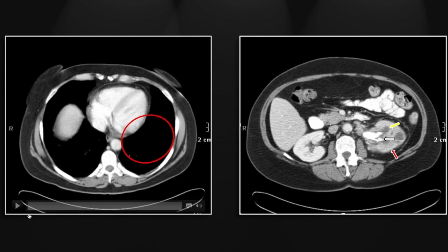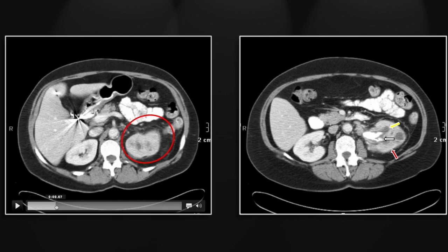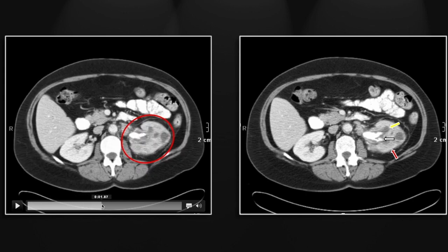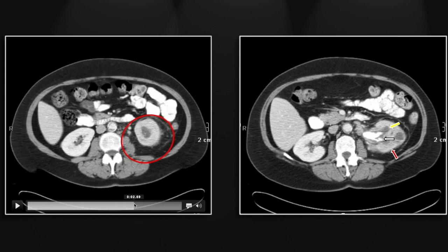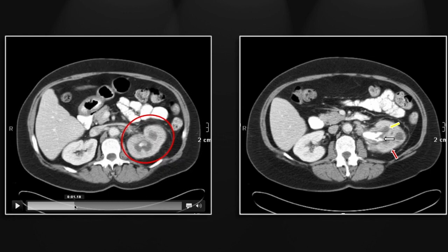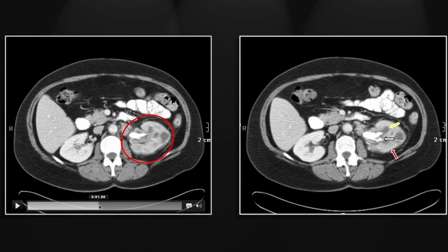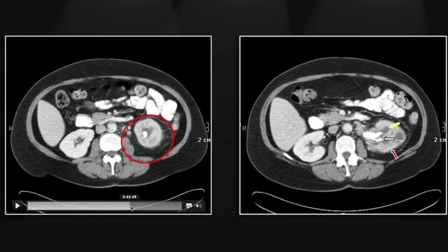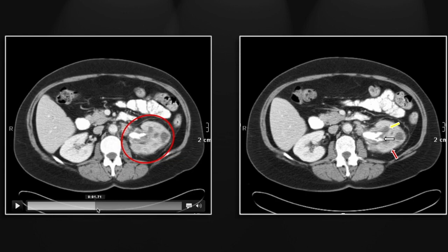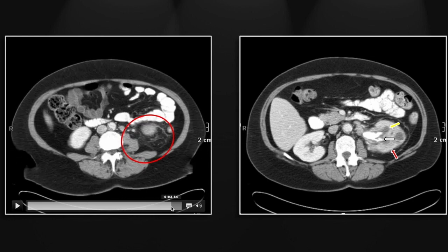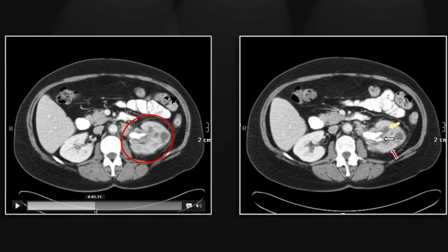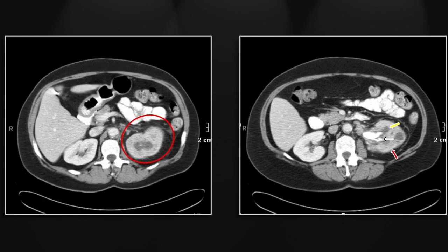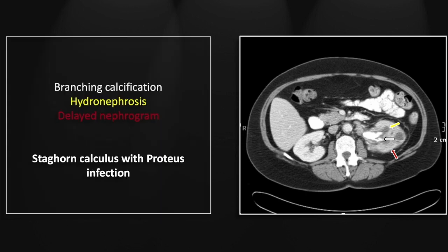This was the classic proteus infection superimposed on this staghorn calculus. You can see its branching characteristics very nicely on the cine — it extends into essentially every infundibulum of the collecting system. There are also hypodensities in the parenchyma that look like renal abscesses or potentially focal nephronias. So that is a staghorn calculus with superimposed proteus infection.